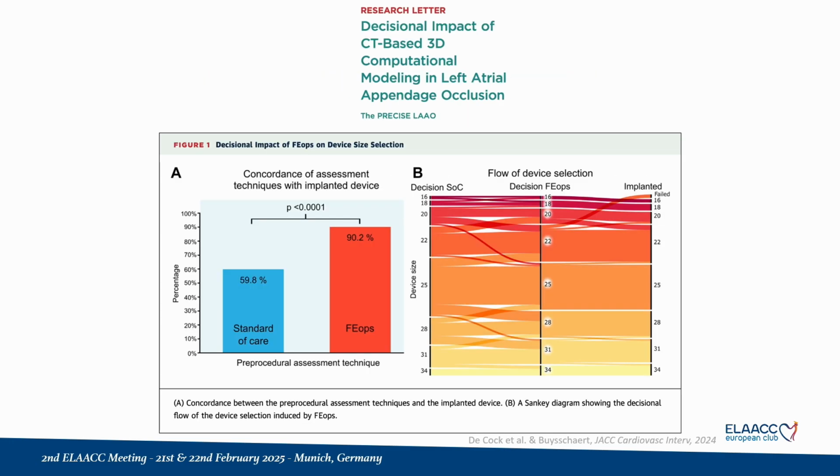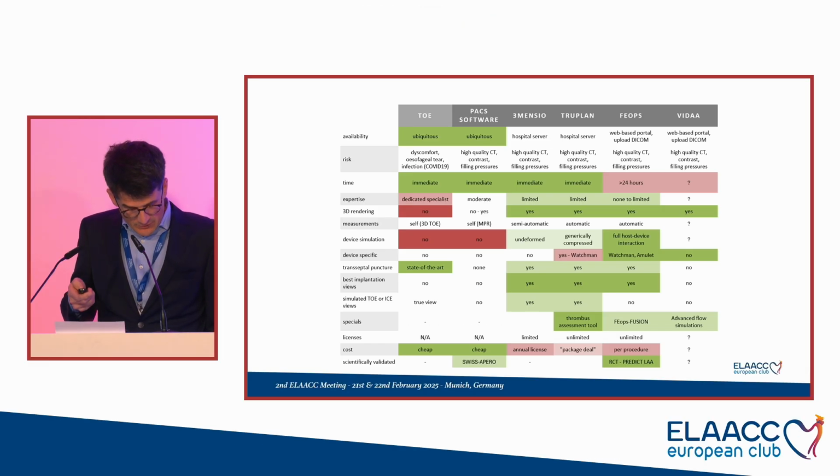We do have data. We did also in our country a small study, 100 patients, because I do agree with you, we need to measure. And so we asked 6 centers to do their regular standard of care before opening for the 3D simulation with FEOPS, and we saw that there was a change in 35% of the cases, and that the FEOPS predicted more and correlated more with what was ultimately implanted. So yeah, definitely it does improve, and we do have data, but we also need some common sense.